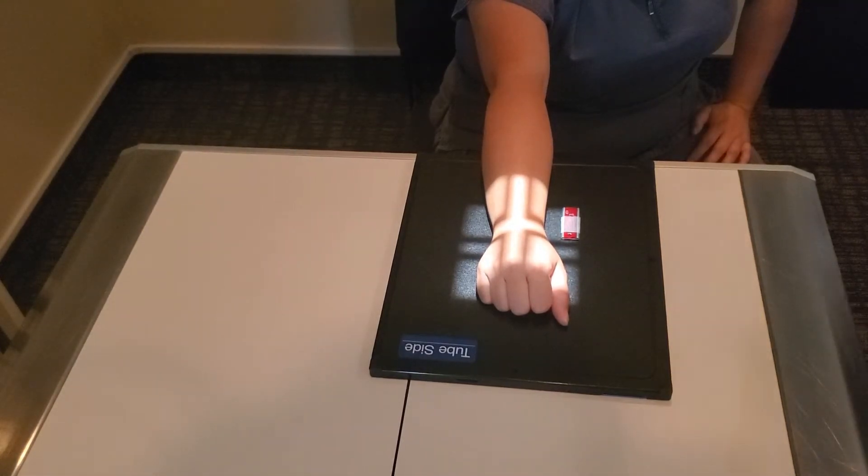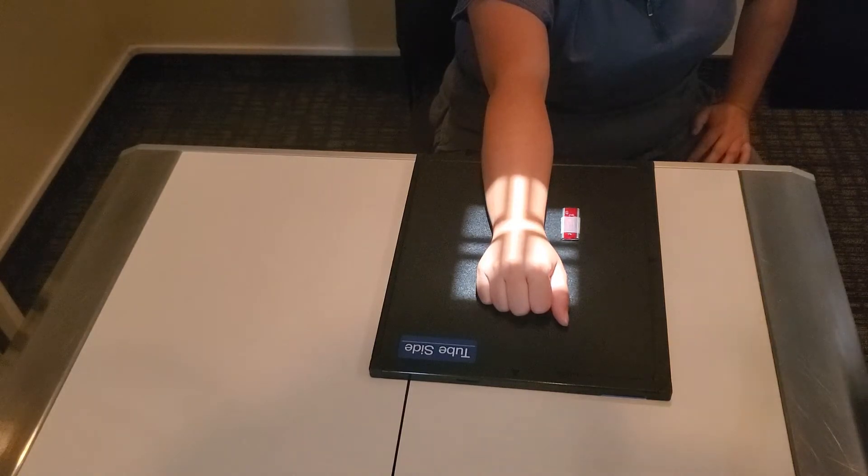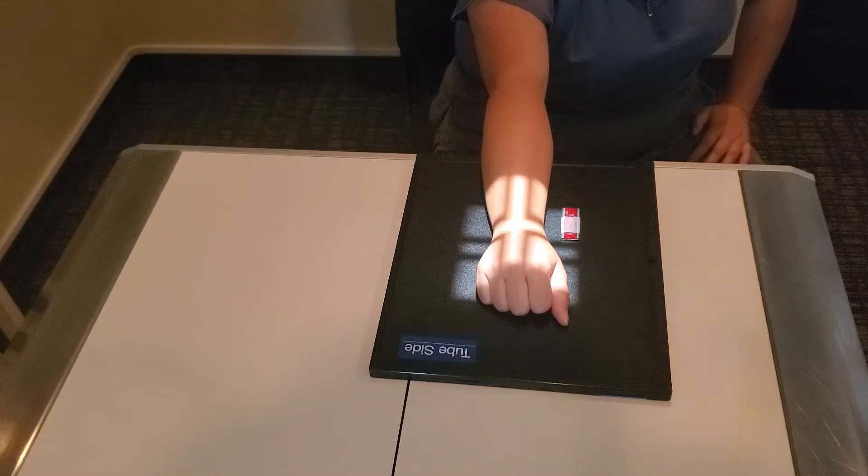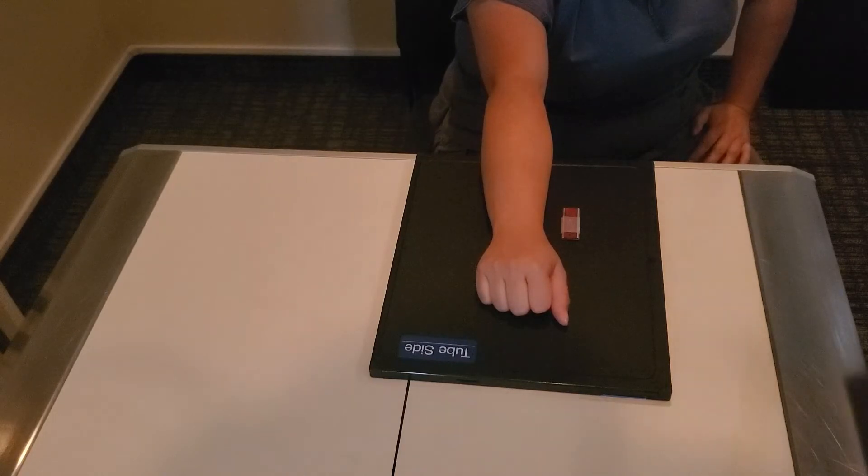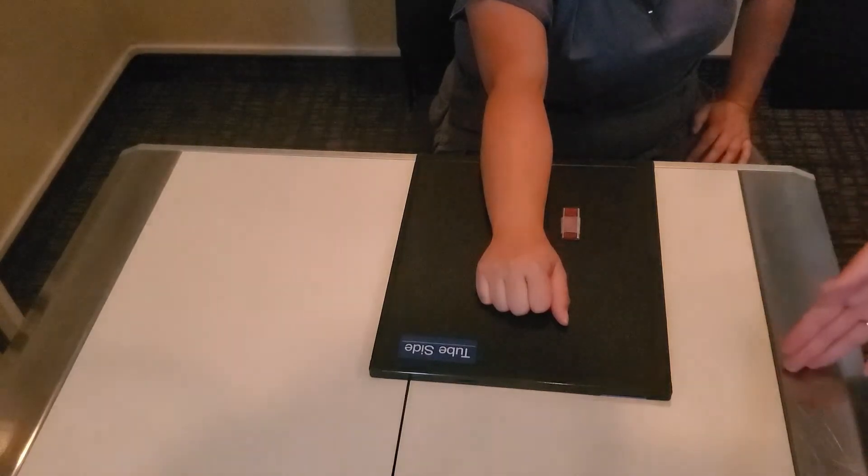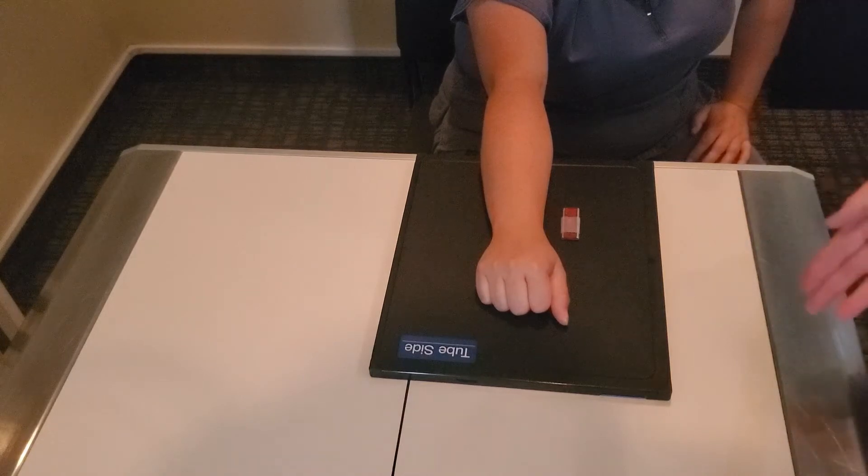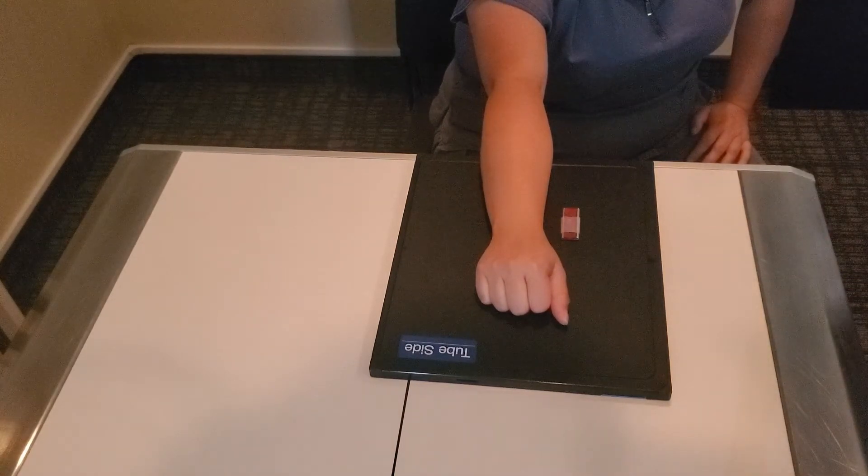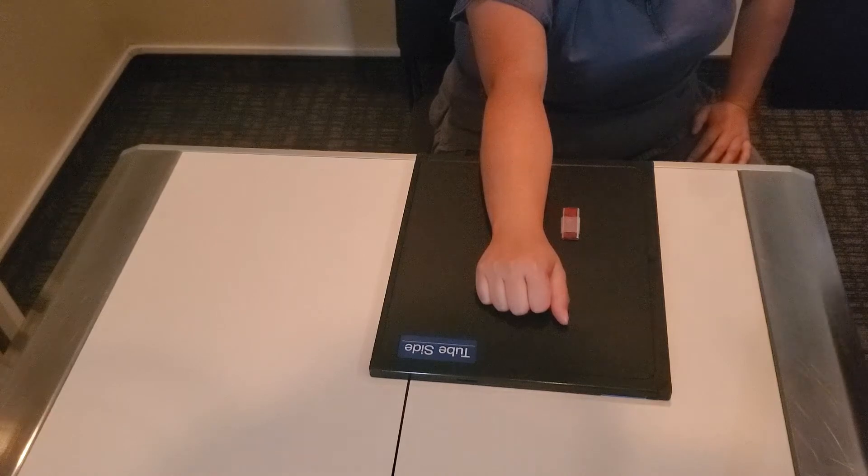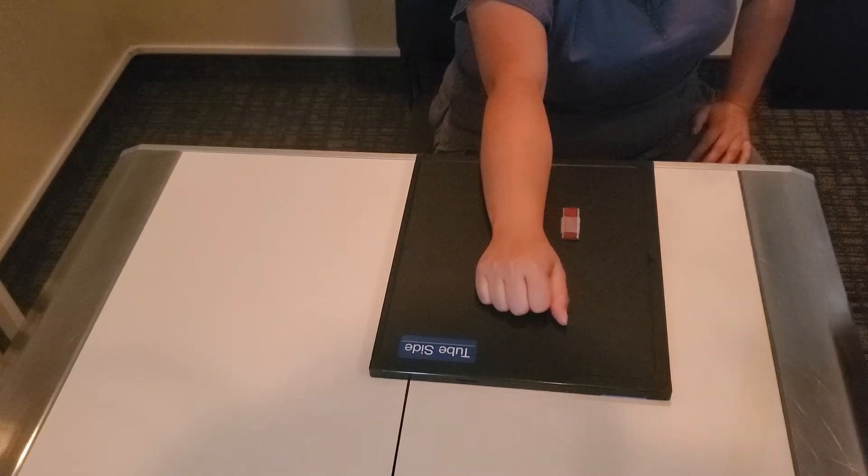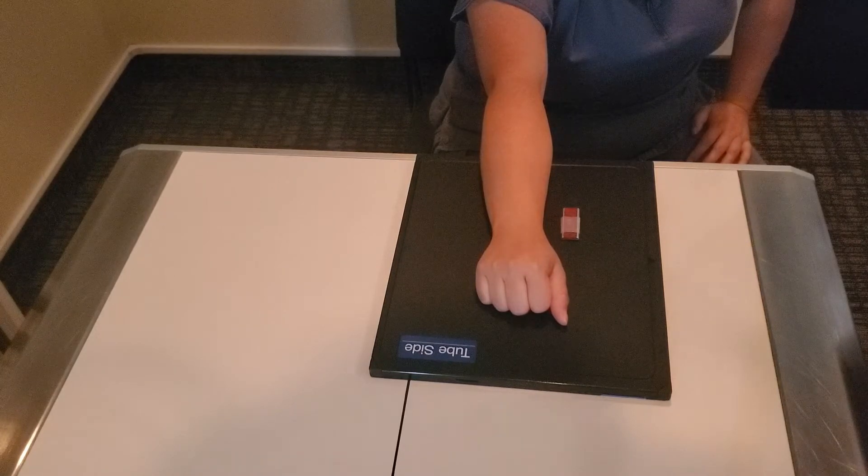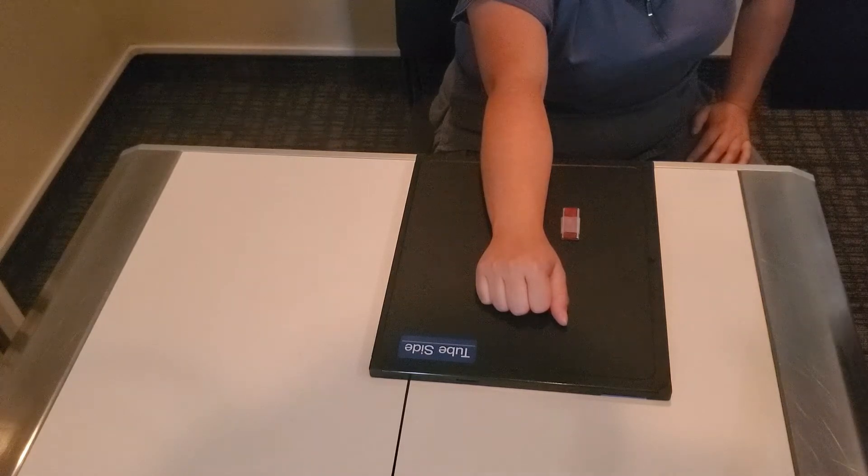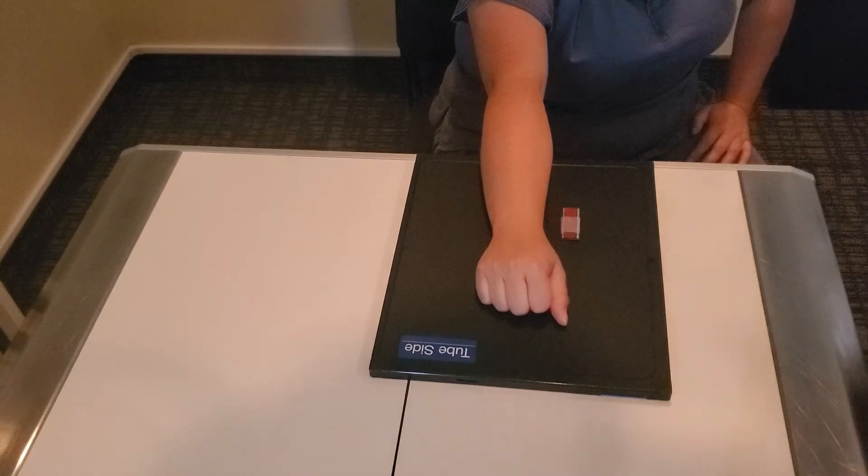Moving from the PA wrist to the oblique and the lateral is really easy. One thing I wanted to touch on though is you guys have to know your techniques for what's considered average. And in this specific program we say the PA wrist is 54 at 2, the oblique wrist is 57 at 2, the lateral wrist is 60 at 2. And this mirrors your hand techniques as well. The sooner you can get it down that your techniques are based off thickness the better you'll be at knowing techniques in general.